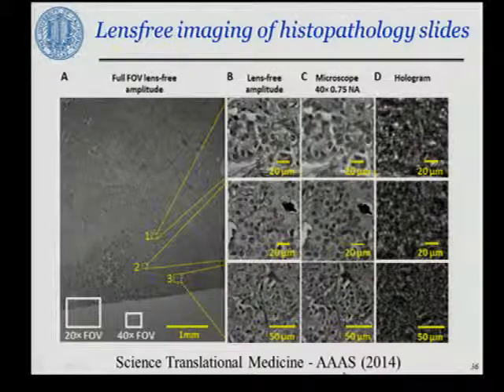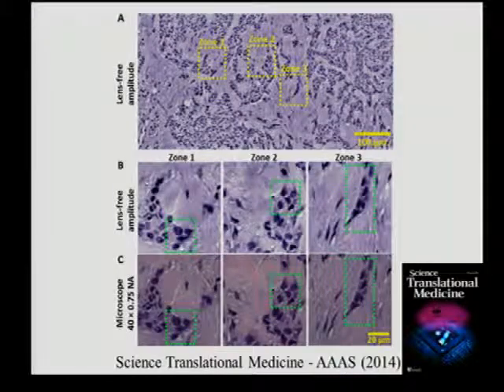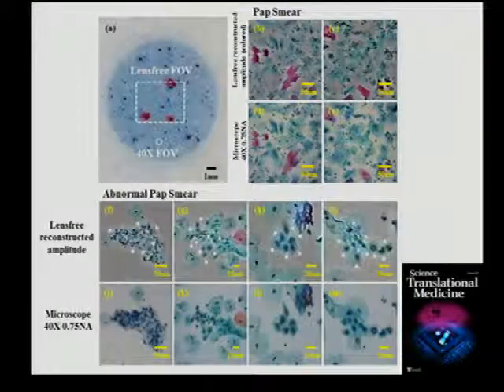To understand how well we preserve details, we've done a blind study with a board-certified pathologist and gave her some of our images and some of the traditional lens-based microscope images to see how the diagnostic value for this case of breast cancer diagnosis is preserved. And we've got about 99% match to a gold standard microscope comparison, validating that you retain the pathological information and spatial frequencies related to that.